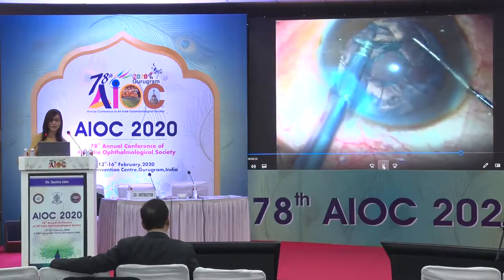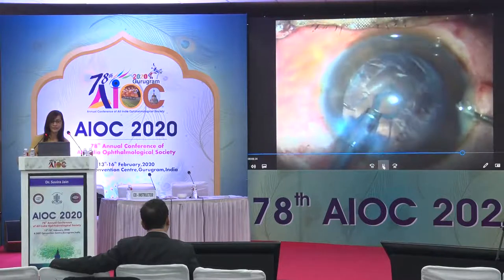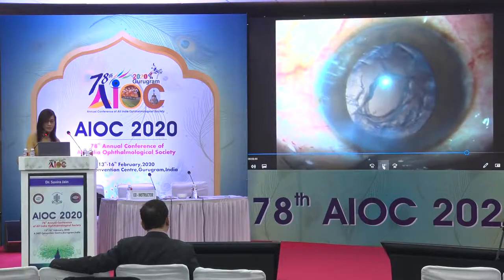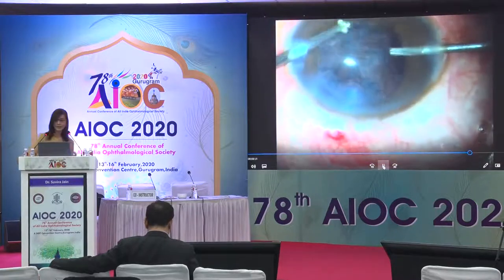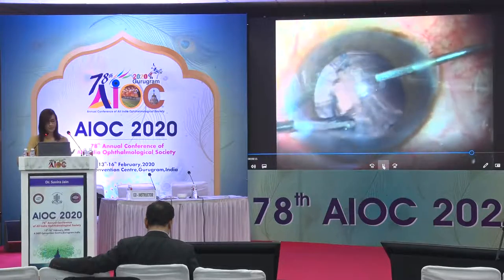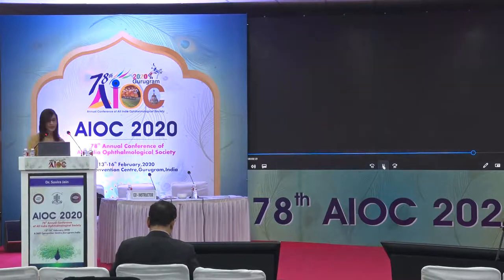Everything is going well, but you can notice the typical fish-mouthing towards the end of nuclear removal, signifying an opening. The surgeon does the right thing by performing a visco-BSS exchange. However, the opening spontaneously enlarges. So the surgeon performs a limited anterior vitrectomy. After clearing the vitreous with the IA cut mode, the surgeon removes all cortex circumferentially, after which an IOL is placed.